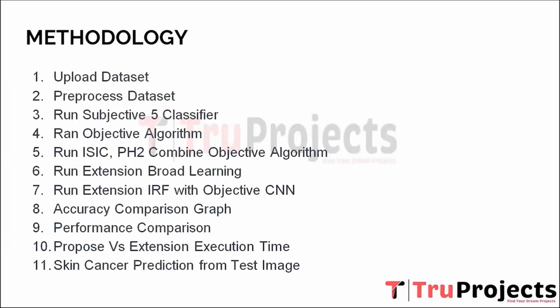Fourth, run objective algorithm. In contrast to the subjective classifier, an objective algorithm based on machine learning or deep learning techniques is deployed. This objective algorithm uses the pre-processed dataset to automatically learn and recognize patterns in features indicative of skin cancer. By relying on data-driven insights, it aims to achieve more consistent and reliable predictions compared to the subjective classifier.